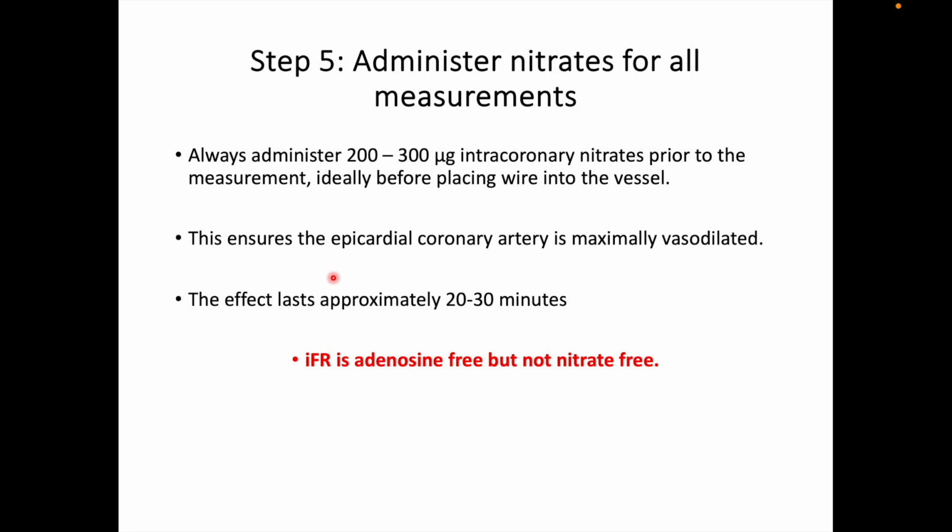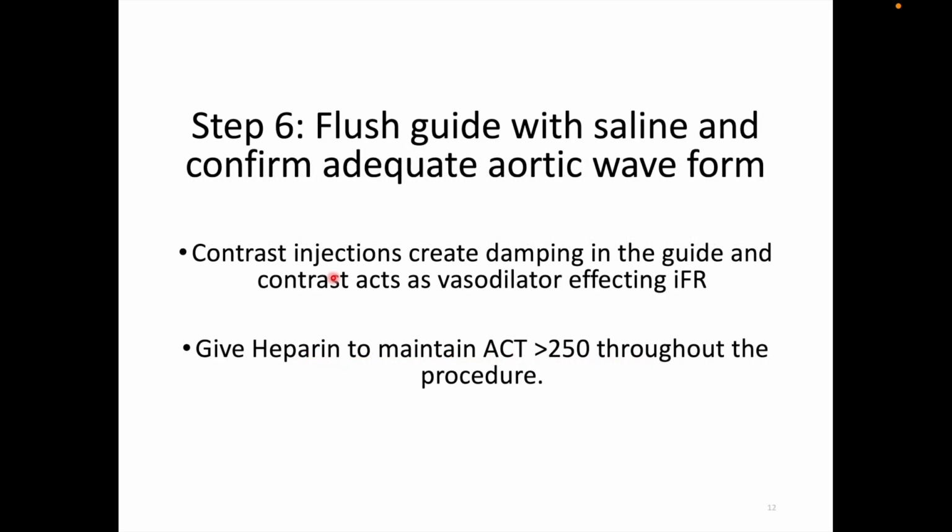Adenosine is only given for FFR. Now you've given the nitrates, you're taking your wire in, your wire is in the guide catheter now. Now is a good time to flush your guide catheter with saline and confirm adequate aortic waveform. Your contrast must not remain hanging in the guide catheter, because it gives an impression of a damped guide catheter if the contrast is still there in the guide catheter.